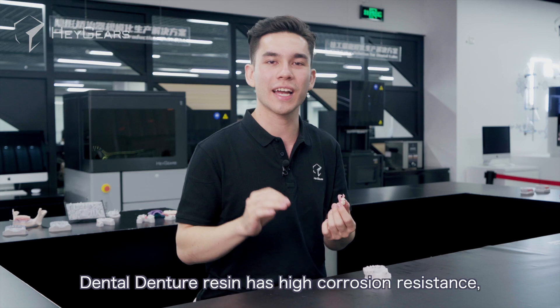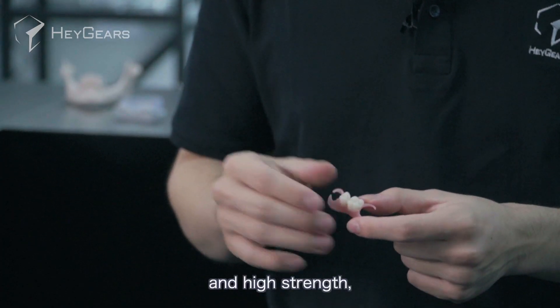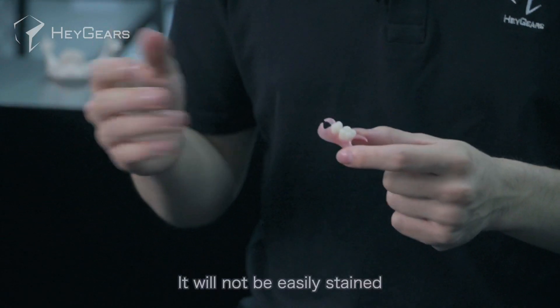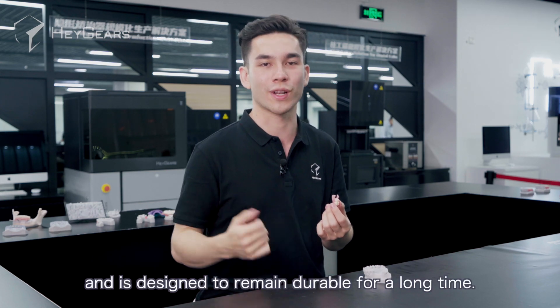At the same time, the dental denture resin has high corrosion resistance, high dimensional stability, and high strength, which can resist the erosion of various kinds of foods in daily life. It will not be easily stained and is designed to remain durable for a long time.